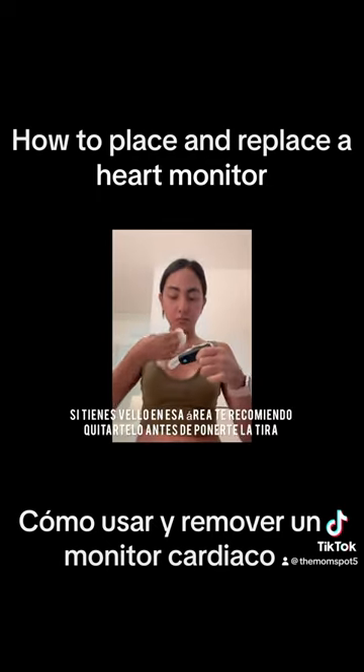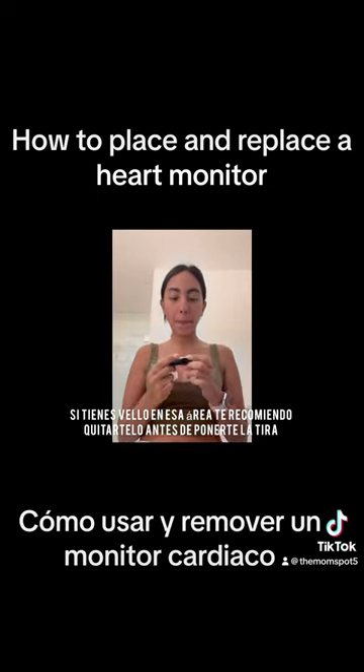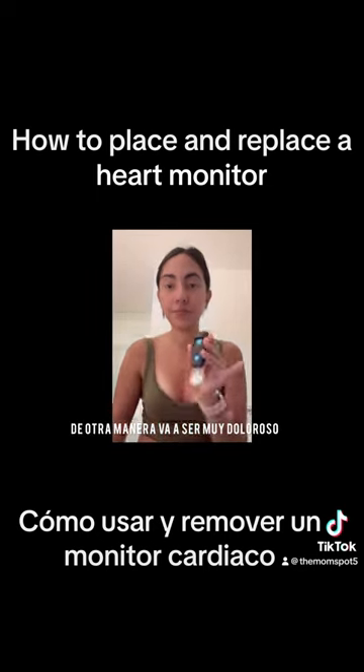If you have hair in that area, I recommend removing the hair before you place the strip, otherwise it's going to be very painful.